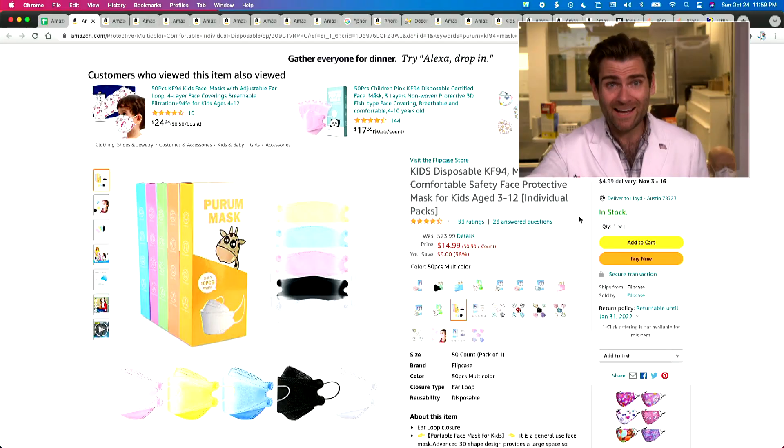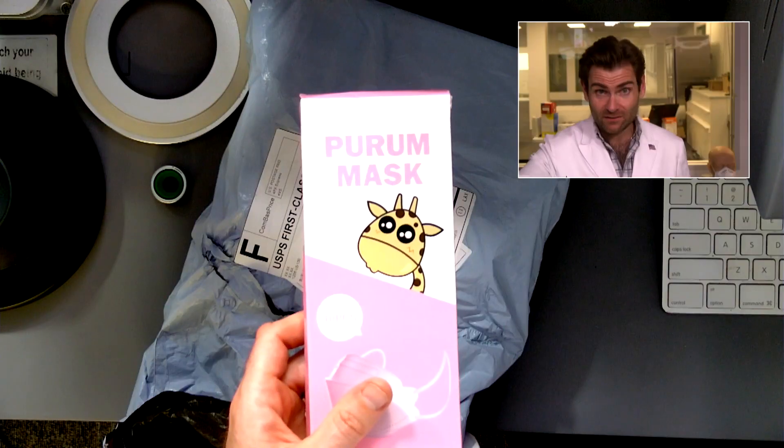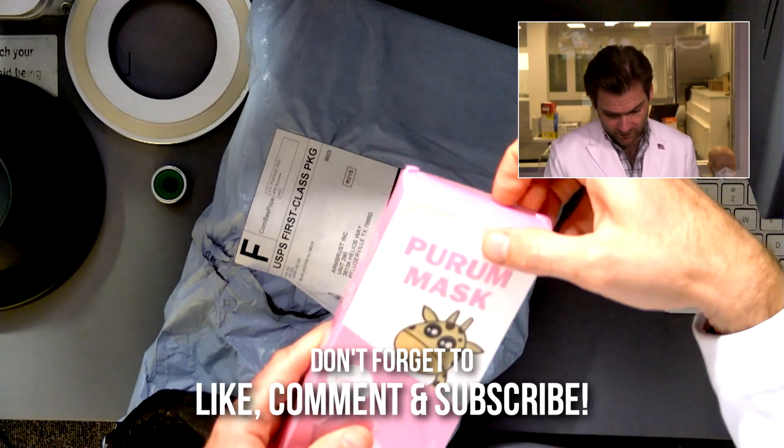Hey everyone, welcome back to the place where we're testing every single mask on Amazon. Today we are looking a lot at kids' KF94s, although I got a feeling that this one is not legitimate. Let's open up the box and see what we find.